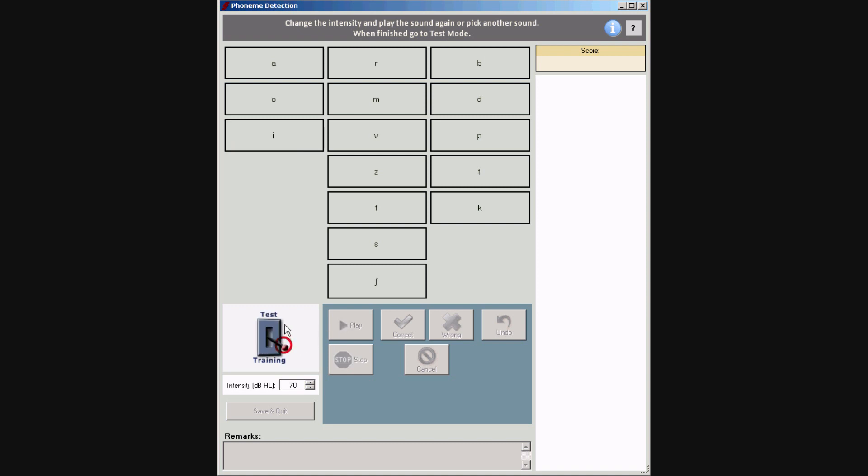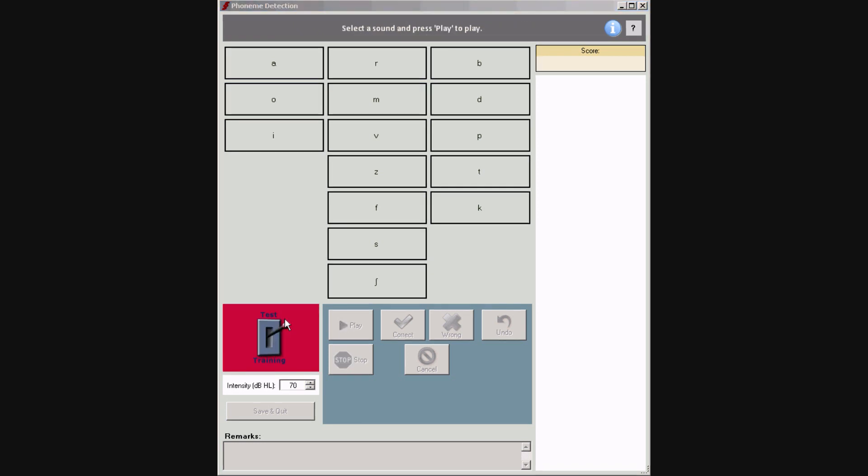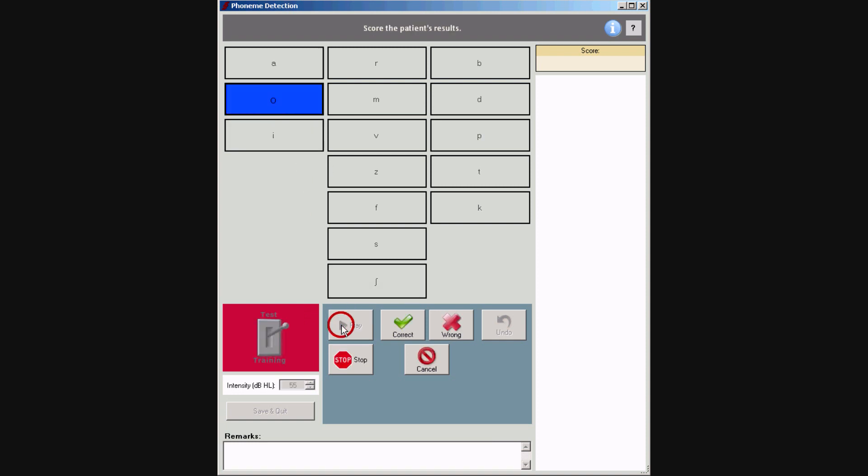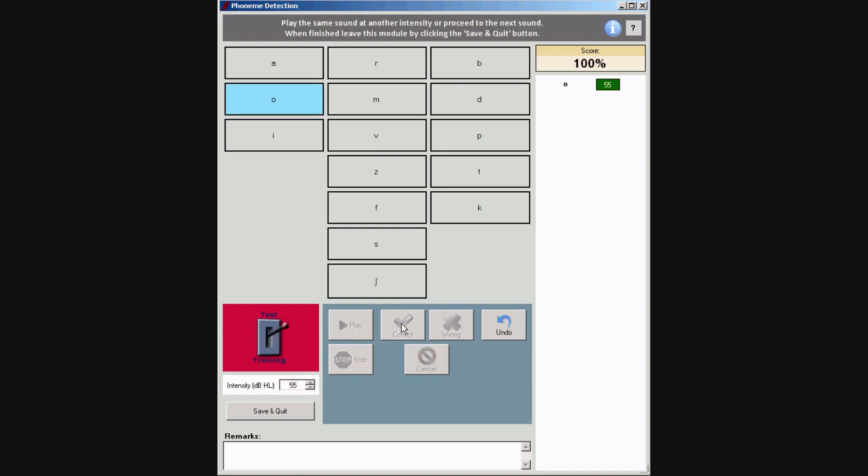After the training, switch to test mode. Select a presentation level and a sound, and press play. Enter the listener's response. Select another sound to play.